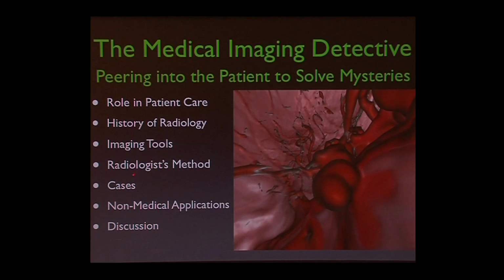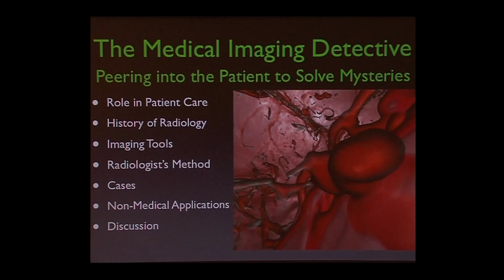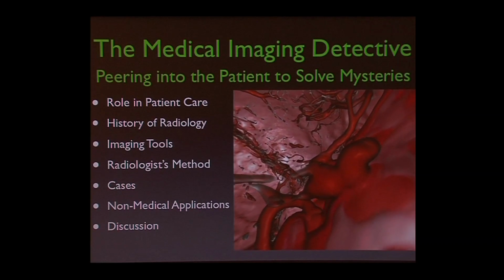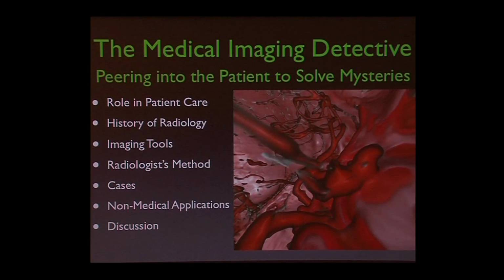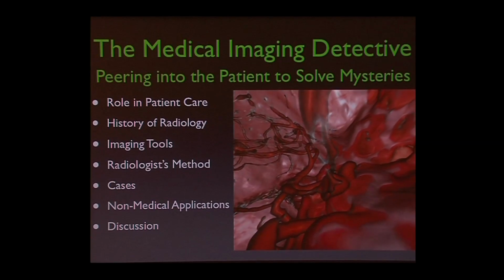We'll go through some of the detective method that we use to solve medical mysteries. And I'll show you some illustrative cases. And then, unfortunately, I don't have time for some of the non-medical applications, which I think are pretty interesting to me, but we'll leave time for discussion.